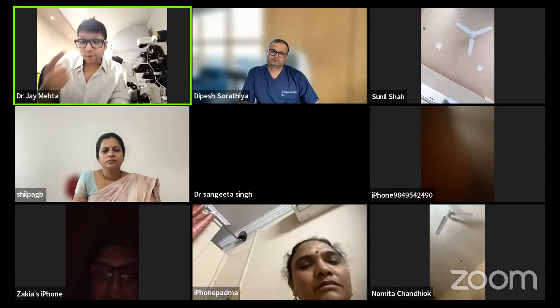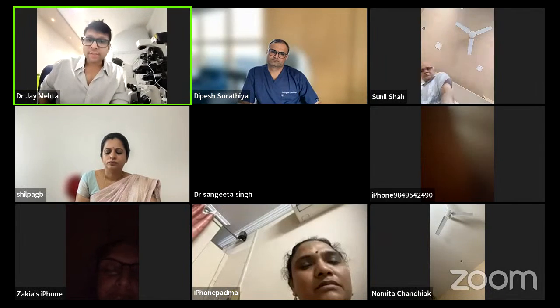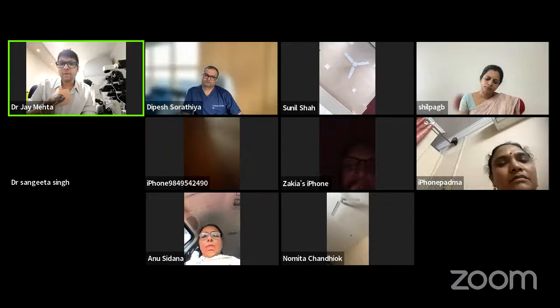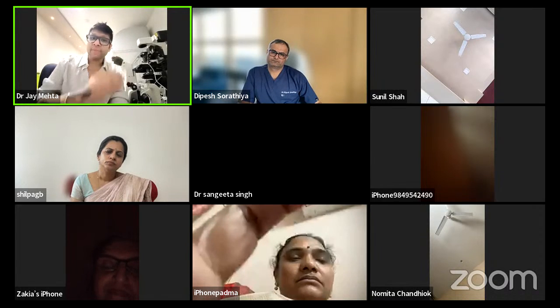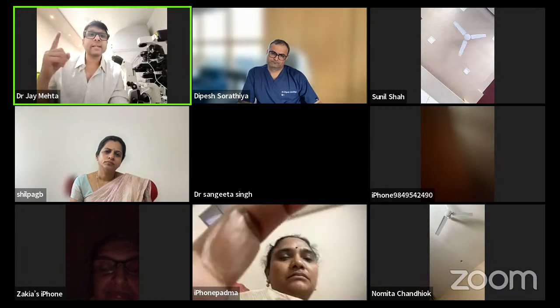Simultaneously, please note one more thing. Irrespective of putting a very good expanded blastocyst in the uterine cavity, it does not guarantee the success of your IVF cycle, because this is your morphological grading. This is the grading of my eye. The video which I showed you on time lapse, if I would have graded that embryo on day 3, I would have said that it is a poor quality embryo. It has more fragmentation, around 20%, and the possibility that it will develop a blastocyst is not very high. But as you saw in the time lapse, despite that morphological grading, it formed an excellent expanded blastocyst.